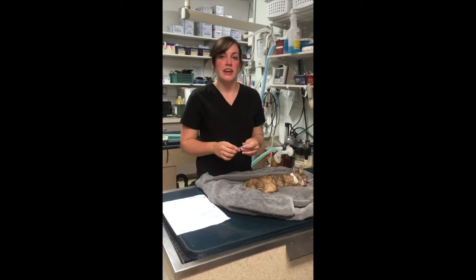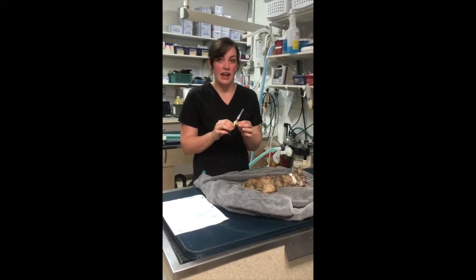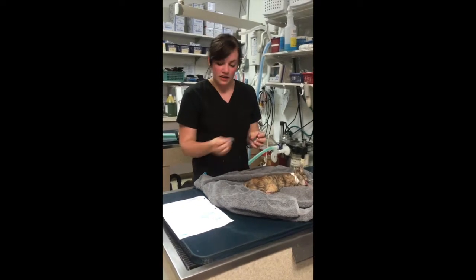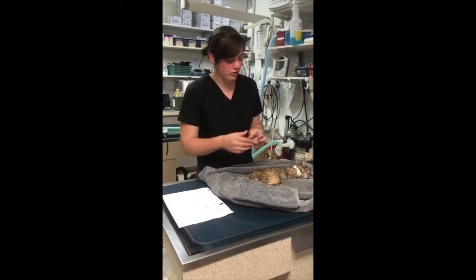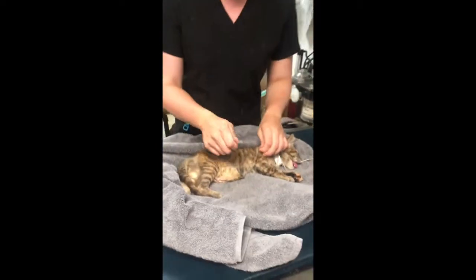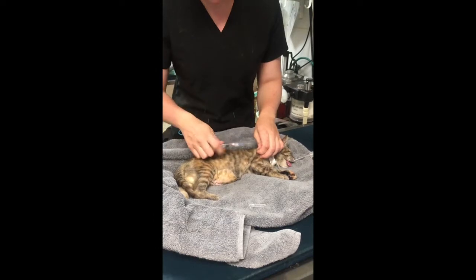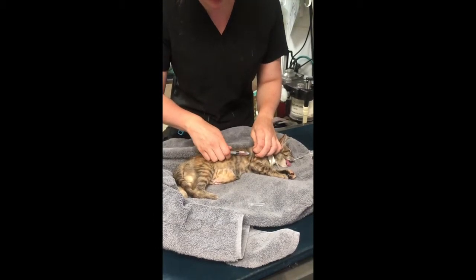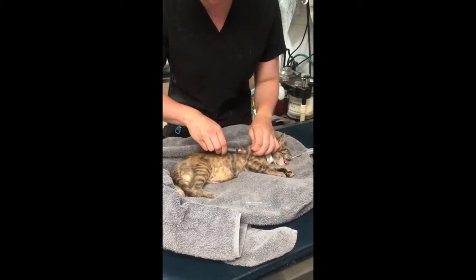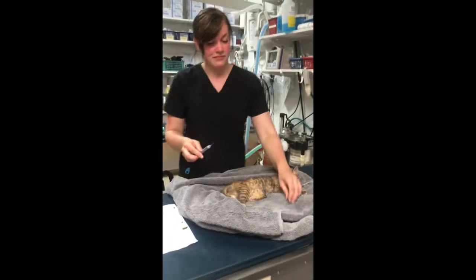Alright, I'm going to be demonstrating how to give a sub-Q injection. We're going to be giving Zinnia a FVRCP vaccine. So I'm going to go ahead and put her sticker there. So when we give a sub-Q injection, we want to go ahead and tent the skin, remove the cap, make sure that bevel's up, insert the needle underneath the skin, pull back to make sure that we don't get lots of air. We didn't, so then I'm going to go ahead and inject. And we're done.